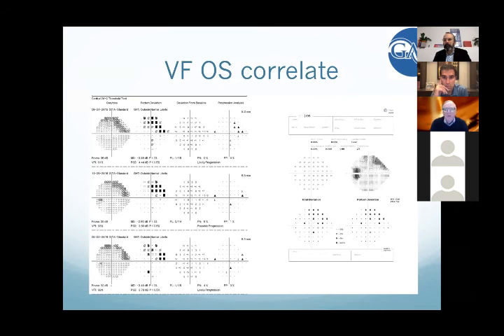So this is definitely a technology that we're seeing. This type of correlation is very common, very reassuring. And I think the indices, like I said, so when I look at these now, I've learned I don't always look so much at the grayscale to start with. If that jumps out at me, fine. I'm always looking at the black boxes, because that's a significant defect. You always have to look at that. And then you put the reliability indices together, and it gives you a pretty good picture of what is really happening.